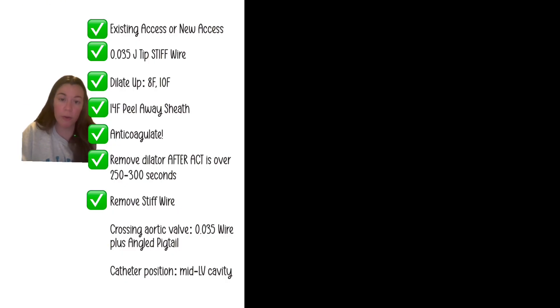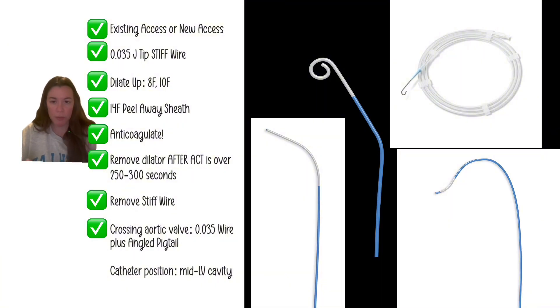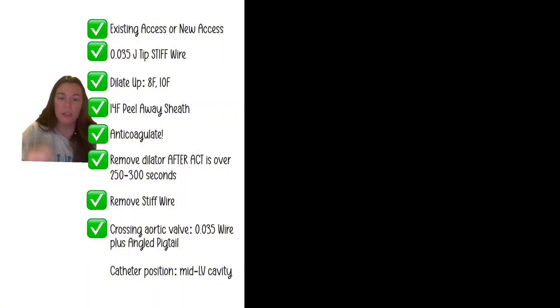Leave the dilator in until the ACT is therapeutic, then remove the dilator and the stiff wire together, because now we need to cross the aortic valve and we're not going to do that with a stiff wire. Get a regular 0.035 wire — 150, 180, 210, 260, whatever you want — and an angled pigtail or catheter of choice; some use a multi-purpose. Cross into the left ventricle and position in the mid-LV cavity, free and clear of the papillary muscles.